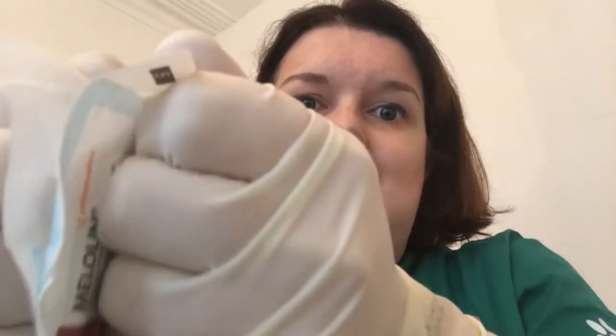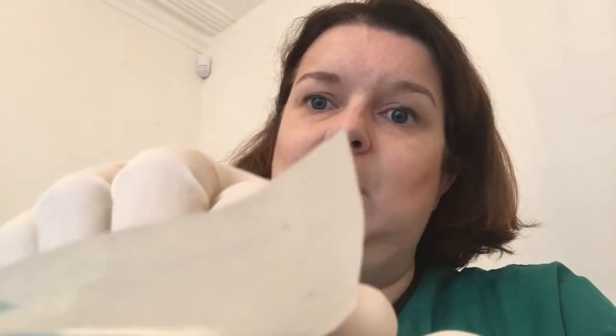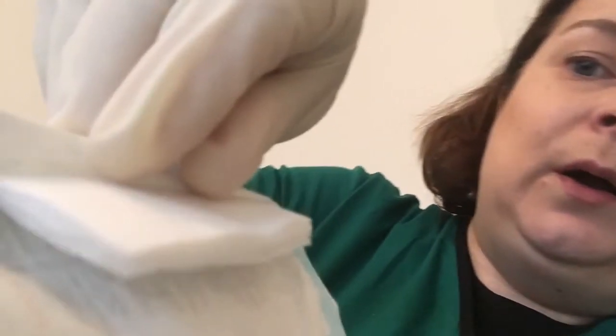If you forget about reading the label, but all you know is that it's the shiny side — open it a little bit. Don't go mad and whip it so it hits the roof and floats away. Open it a little bit, look at both sides, realise where the shiny side is. You can put it to one side, get all your equipment ready. When the time comes, open it fully, pinch the back — and you're there.